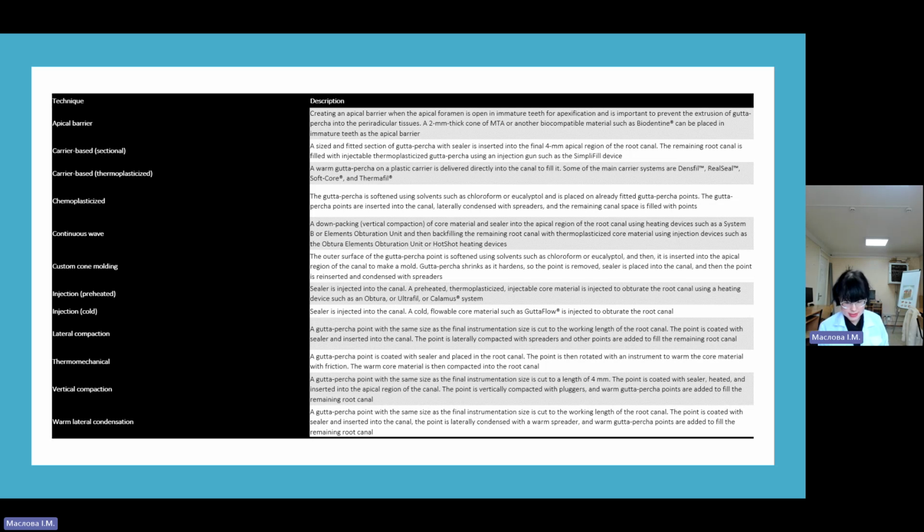Calcium phosphate-based sealers such as Apatite Root Canal Sealer, for example, are available. The presence of polyacrylic acid in this formulation is said to cause cytotoxicity, and questionable results have been found with regard to their biocompatibility.